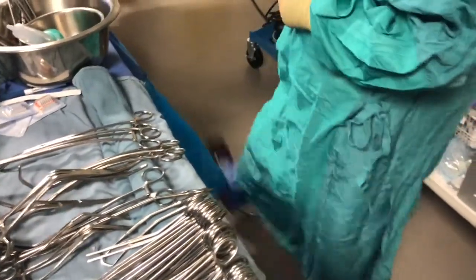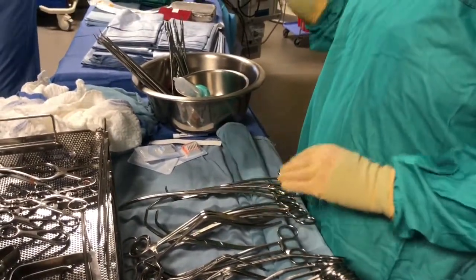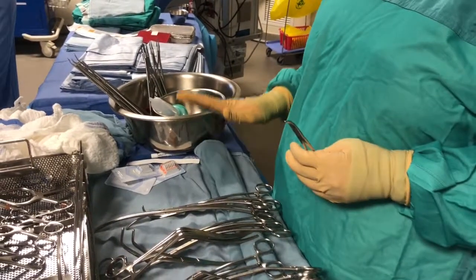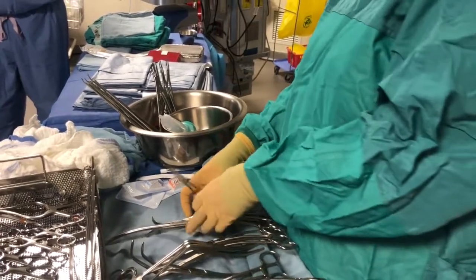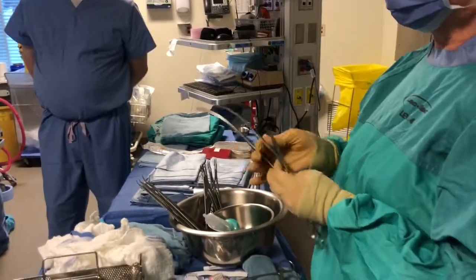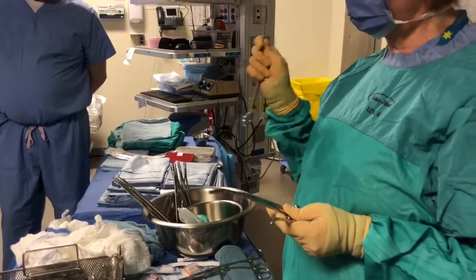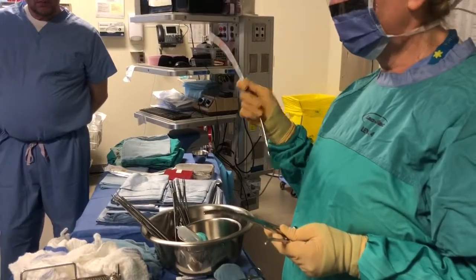And that would be contaminated, like I would have to get rid of that. But you keep it in the count. It has to stay in the room because we've counted it. So they would just put it onto that stand over there and leave it there. Now being in vascular, you have to say to yourself, well, I need that. We do have 2 left, a big one and another one, so we should be all right. If we lost the big one and there was a big guy coming in, then I would ask them to call for another one for sure. Because there's a chance we're going to need this big one quickly, and I'm not going to have it on my table. So I would call for it, okay?